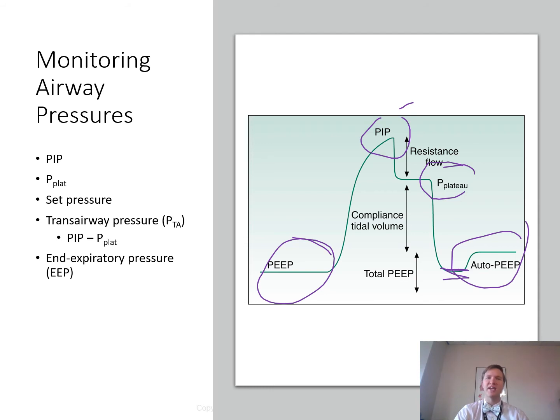An airway pressure slightly greater than 0 can occur at the upper airway during exhalation if a constant gas flow is moving through the circuit. This constant gas flow is referred to as bias flow. Most ventilators will have some form of bias flow or base flow. It's used to help the ventilator detect flow changes during exhalation that allow for triggering. So you'll probably have bias flow through the circuit no matter what. In most modern ventilators, bias flow only occurs at the end of exhalation, right? So there's no resistance to flow at the beginning of exhalation. So it only does it later on, right?